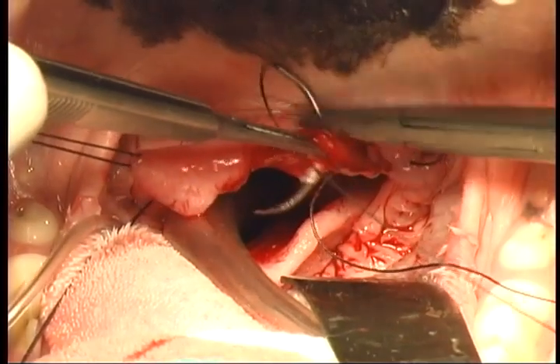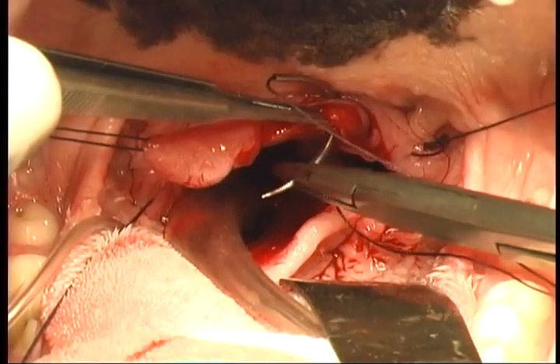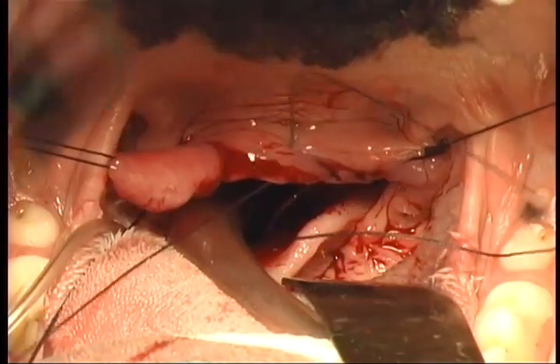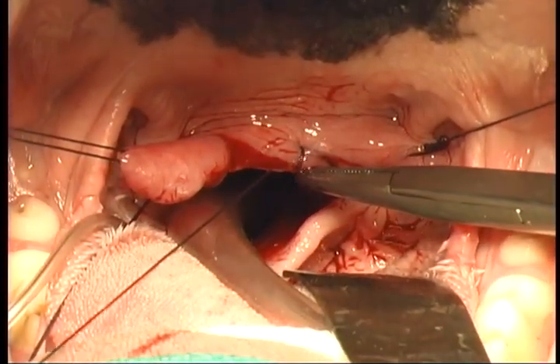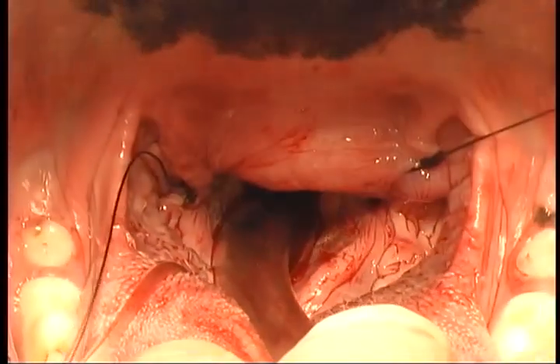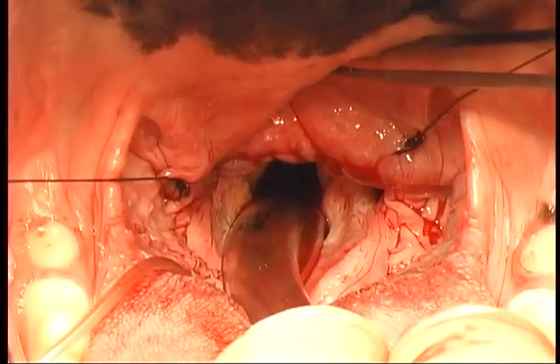Placement of these sutures is critical to encourage hemostasis through suture pressure. You can see in this case nothing has been done to attempt hemostasis other than the simple continuous closure of the mucous membranes, creating suture pressure that will allow adequate hemostasis.